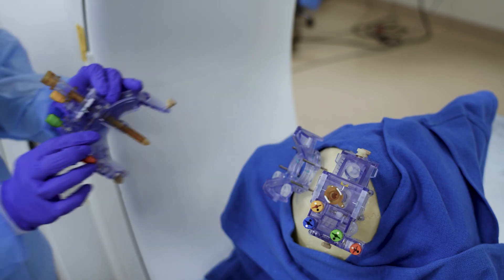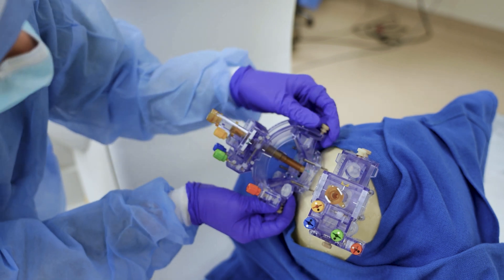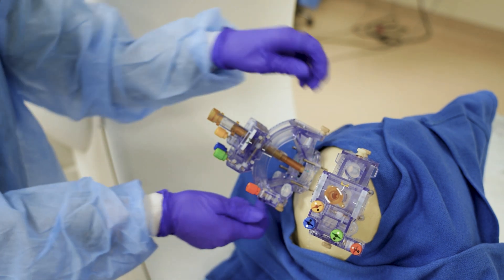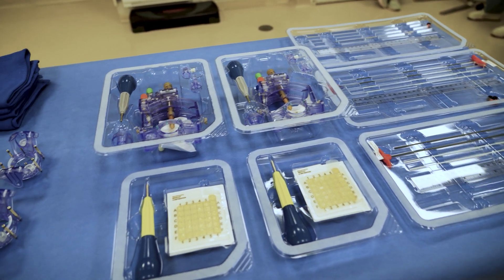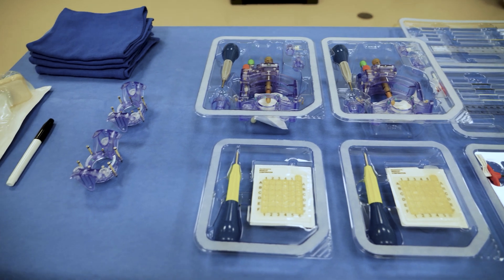With this example of a bilateral DBS lead placement, completing the insertion steps simultaneously decreases the required number of scans and increases overall procedure efficiency. Each kit arrives sterilized, calibrated, and ready to use for every case. There are no components to reprocess, increasing the feasibility of performing multiple cases per day.